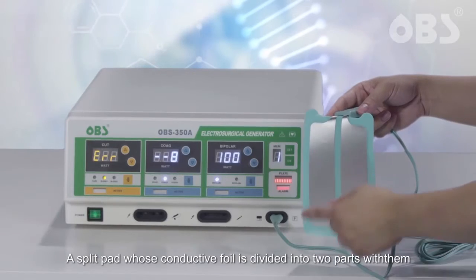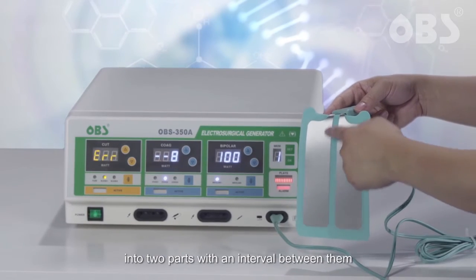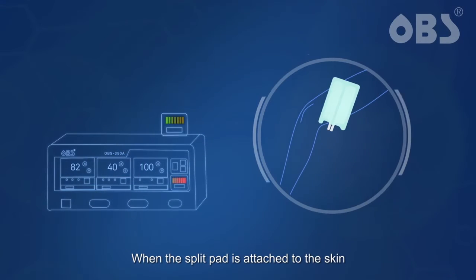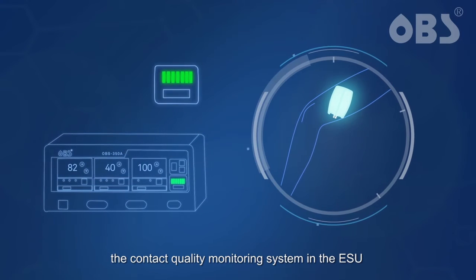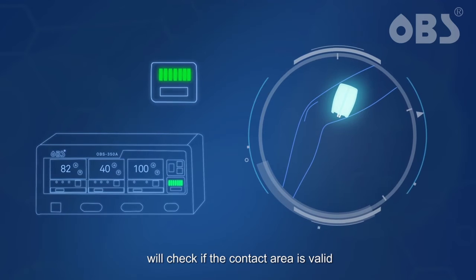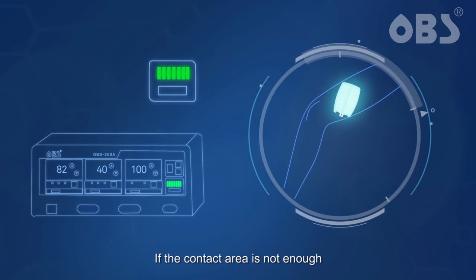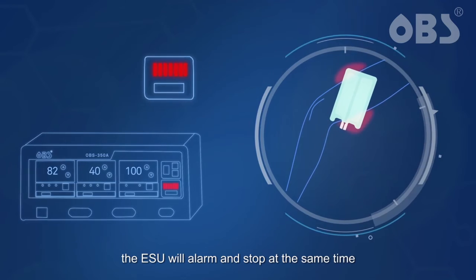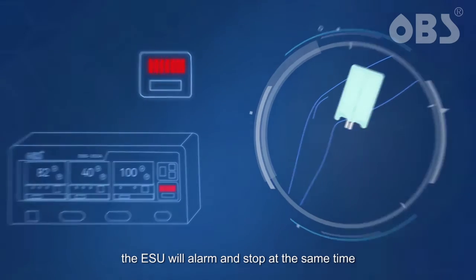A split pad has a conductive foil divided into two parts with an interval between them. When the split pad is attached to the skin, the contact quality monitoring system in the ESU will check if the contact area is valid. If the contact area is not enough, or there is a short circuit, the ESU will alarm and stop at the same time.